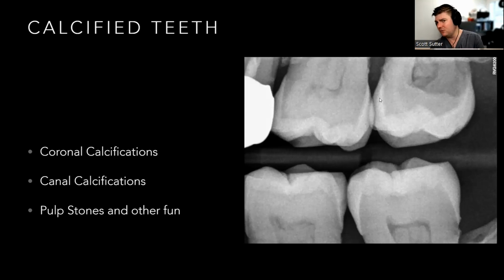And I like this bitewing because it shows a case where you have all of them. Looking over at the bitewing, you can see the canals are definitely a little bit thin here. You can't really see the mesials. Definitely seeing some shrinkage in the actual coronal aspect compared to, say, 19. And then you can see the big pulp stone that's hanging out here. We'll talk about how all of these form and why that's important.